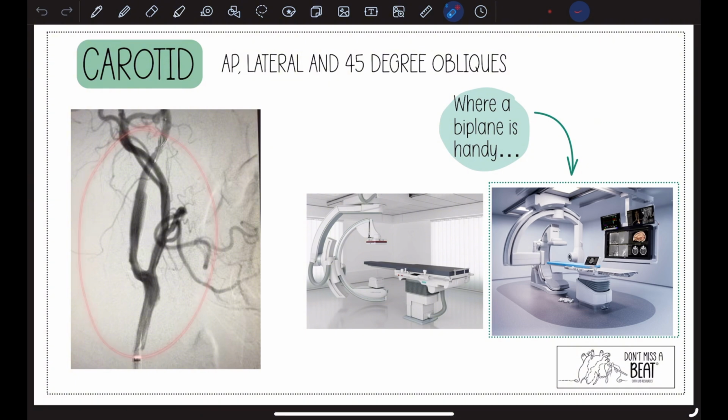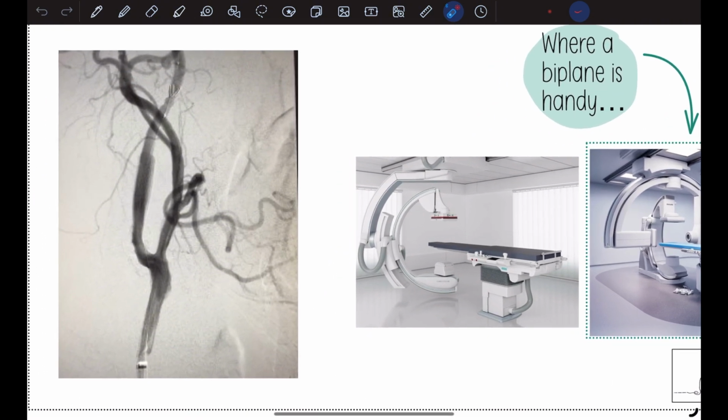We'll talk about the anatomy in a second, but I'll dive in here a little bit. So the aortic arch is here. You have your common carotid, and then you see it bifurcates. Now notice, if we remember from before, the SFA versus the profunda, what is the kind of difference between this vessel and this vessel over here? One is more straight and one has branching. Well, the one that's straighter is the internal carotid.